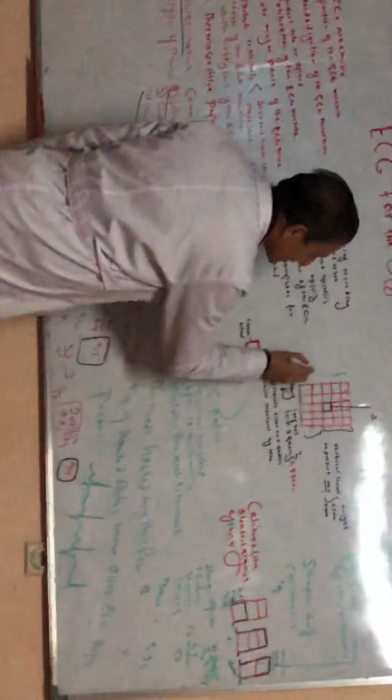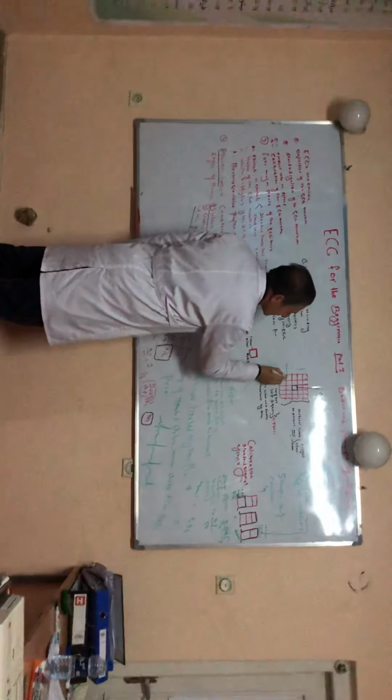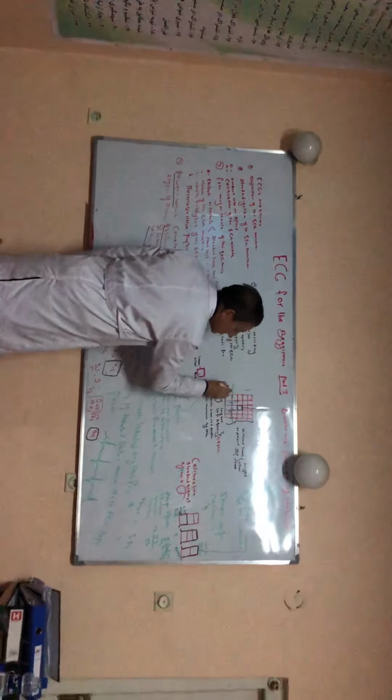So as I mentioned before, this ECG paper is thermosensitive. This is the stylus bar. This is the trace. And this trace, when we combine it with the complexes, makes the ECG graph. What else remained?